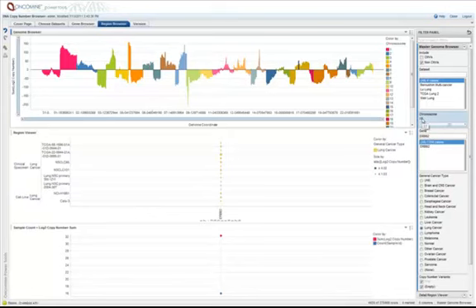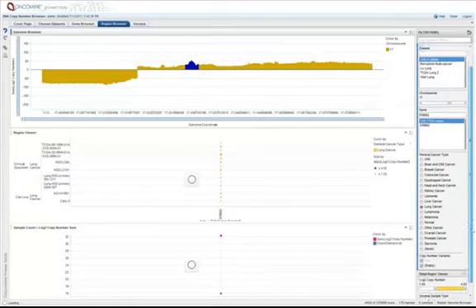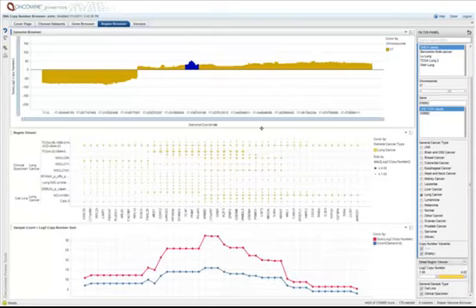So what it looks like is we have a region of the chromosome that shows relatively increased amplification relative to the surrounding area. And what we can do is select this region and ask the question, is HER2 the likely driver based on the focality of the aberration? So let me zoom in a bit here.